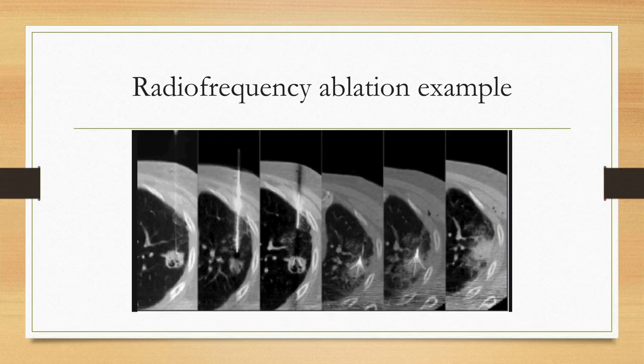And then these are just some pictures from a radiofrequency ablation. So this is the patient's skin here. This is the tumor. And this is the needle with the probe coming into the tumor here. You can see it opens up, so it really gets into that mass here. These are subsequent slices. And then you can see this is actually post-treatment, so you can say, wait, it got larger. Why does it look bigger?